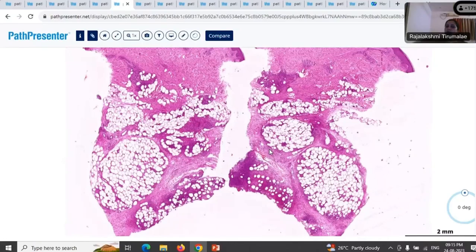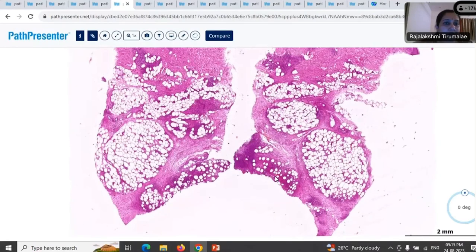So why do we use this word predominantly? Why don't we say just septal and lobular? See, this is not a watertight compartment, right? This shows you that even erythema nodosum, a so-called classical septal panniculitis, can have lobular involvement sometimes. And what is typically described under lobular panniculitis can also show septal changes. The textbooks don't read; it's we who make up the books and the criteria, so there's quite a bit of overlap. What you're seeing here is a predominantly septal panniculitis.